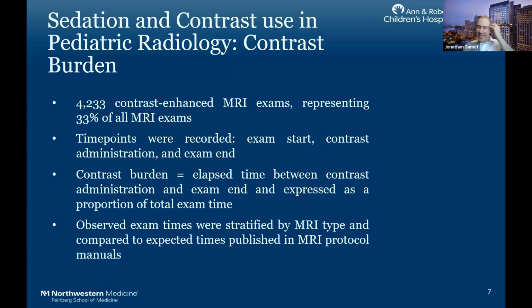And you call them and you say, well, why are you still scanning it? How are you still on the scanner, right? So there's a lot of time that we don't really think about. And that's what we want to capture. That's what we call observed times. What were the real times? And we actually also then looked at the MRI type and compared that to what we thought the exam should take. So if it says it's only 20 minutes for a knee MRI, how long did it actually take, right?